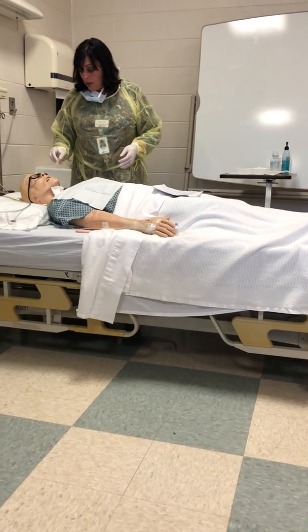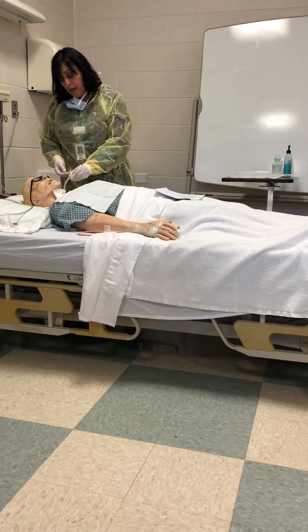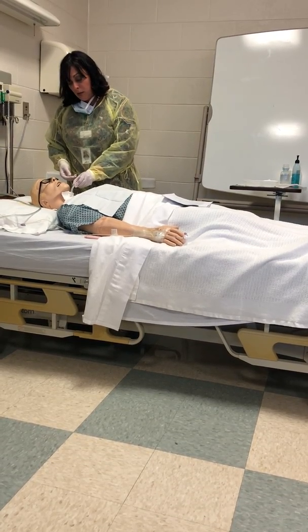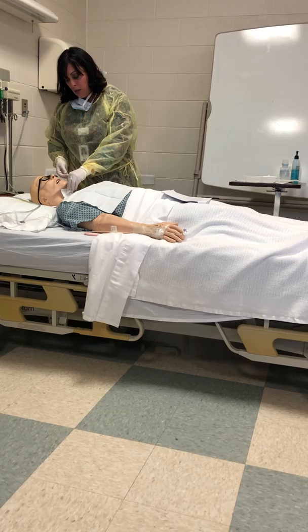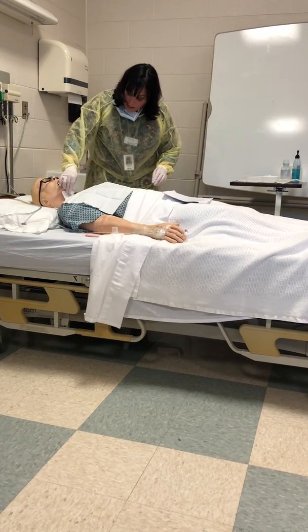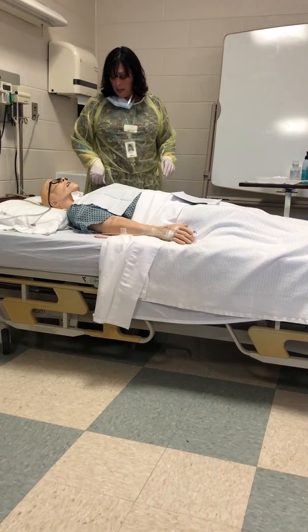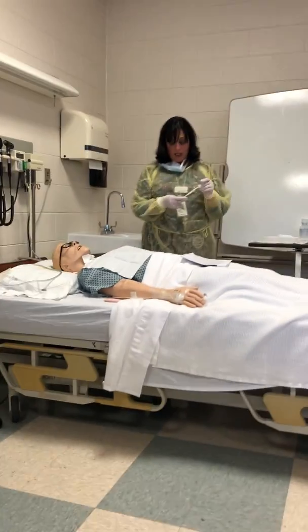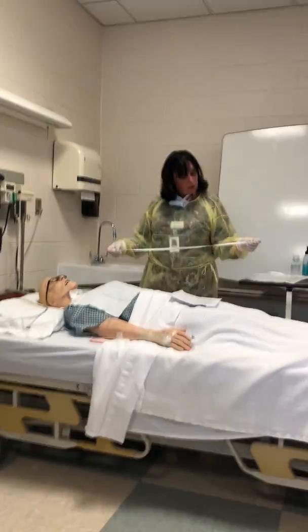Okay, so then you go a little bit at an angle, sideways to it, and then you twist down to put it back in. Line your little guy up and twist it back into place. And that's done. Most places do not have these. We do because we're special.